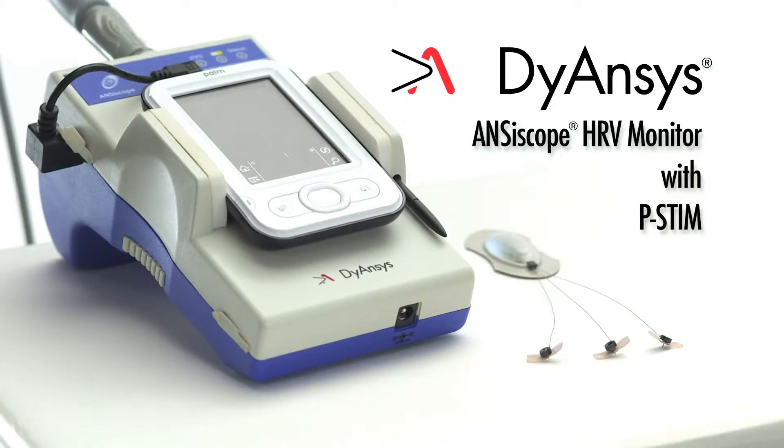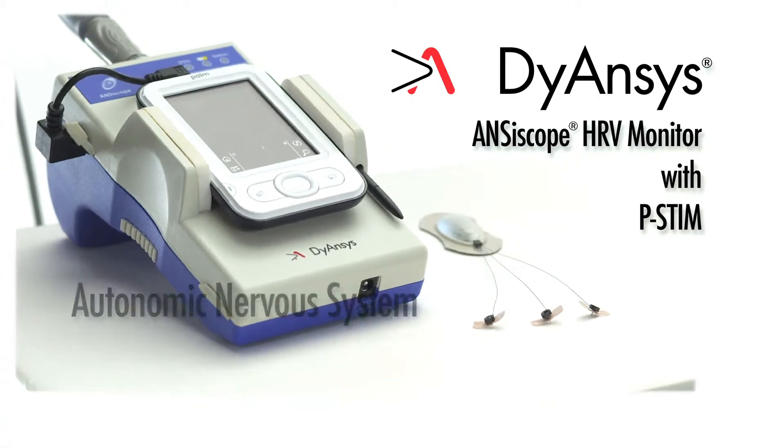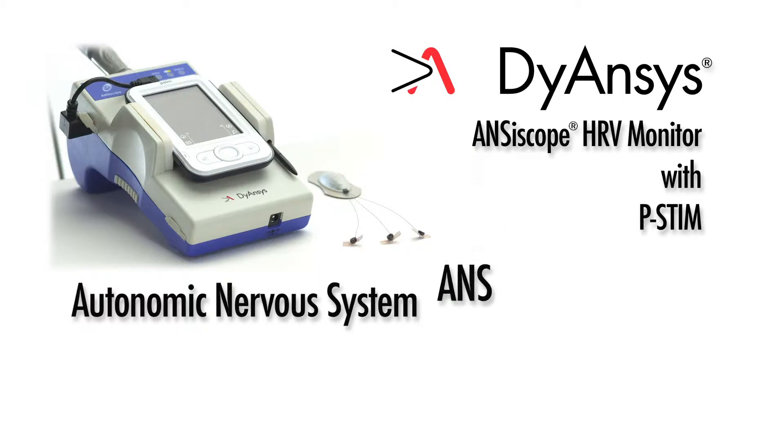The Anciscope HRV Monitor. The following is a demonstration of two highly accurate Anciscope measurements of the autonomic nervous system, better known as ANS. These measurements maximize the effectiveness of p-STEM therapy.